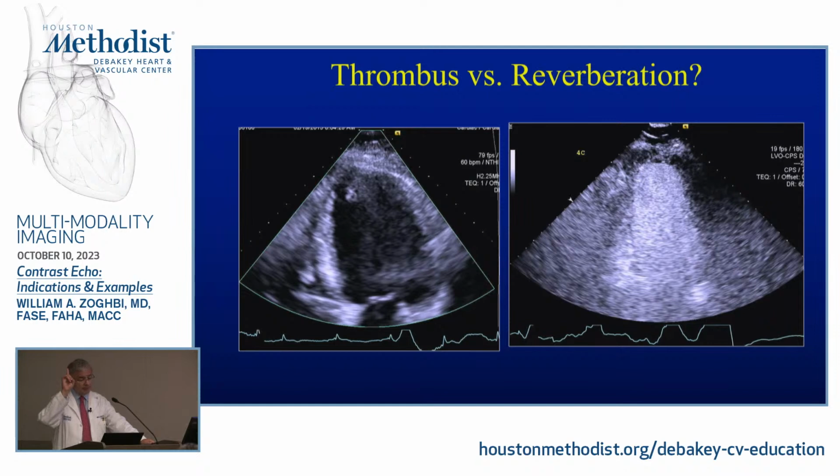M mode won't help you, because what you see, you're going to see on everything that you have. And most likely, what you're going to see is a color Doppler. Is there TEE on this island? Are you kidding me? This is either the Cayman Islands or it is not available on the beach. No point of asking for CMR.